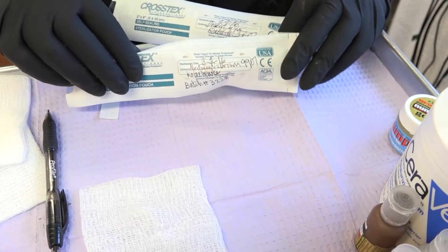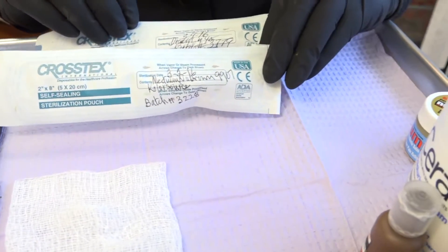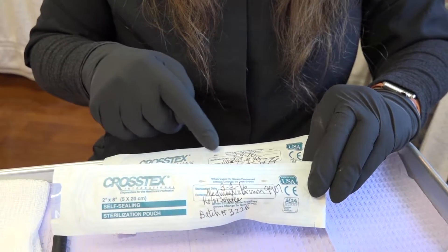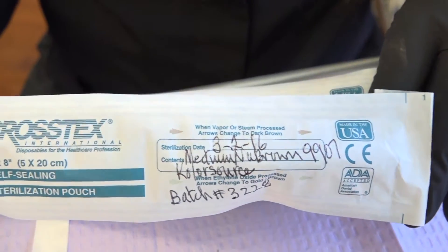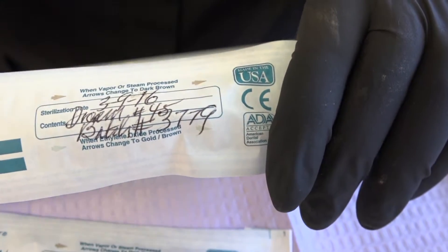When you gas sterilize something by vapor, or whether you steam sterilize it by autoclave, here are your indicators that will change colors. This one has already been sterilized, and this one we'll take into the autoclave.